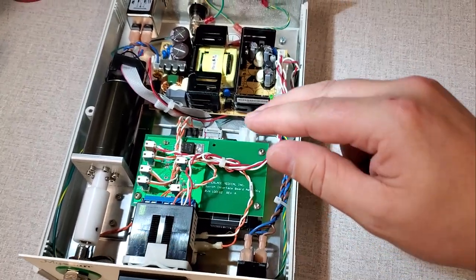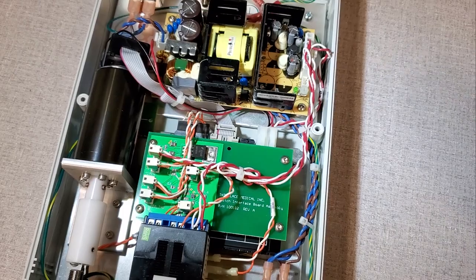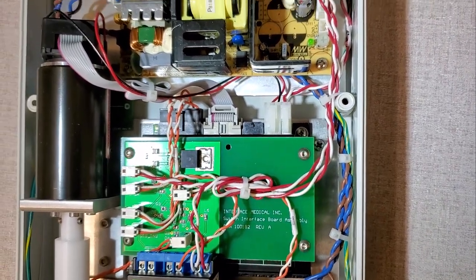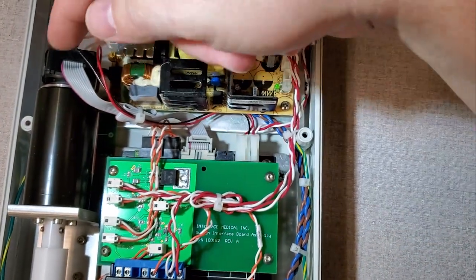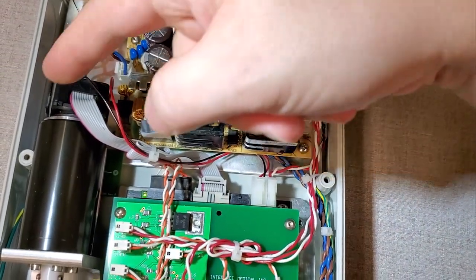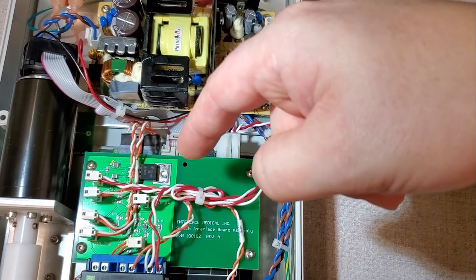But the reason I know that this is a servo is, first off, you can see the DC wires coming in here, and this guy back here is an encoder. And the encoder feeds in down here to your servo driver, and that is your feedback. So what it does is it kicks out a certain amount of voltage, and it will spin this guy up using pulsed DC. And then this guy here detects and gives a feedback for how many revolutions it has provided.